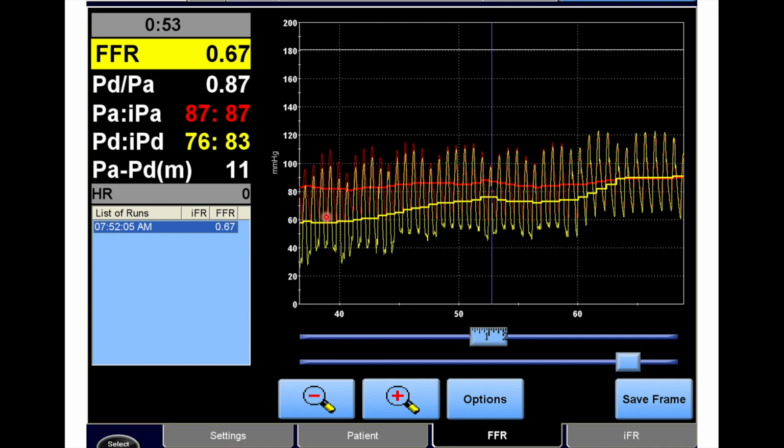But you also see that there is diffuse disease in the LAD segment, and this step up that you see here is right at the ostium of the left main stem. So that's where the more significant part is. So this patient has diffuse ostial left main stem to mid LAD segment disease and an obstructed OM. So this patient opted for CABG.